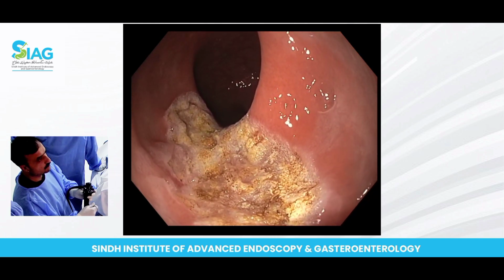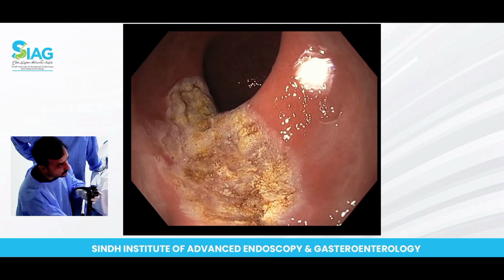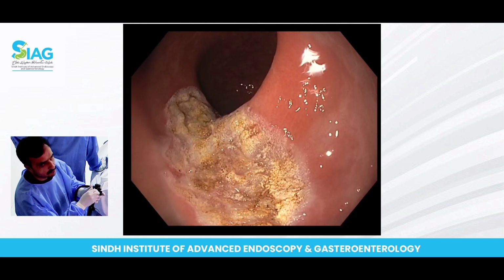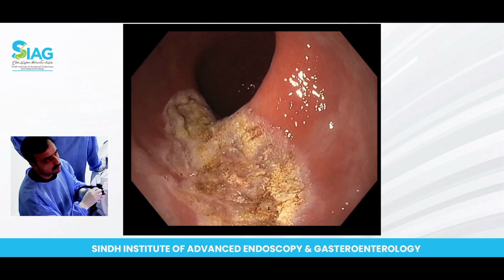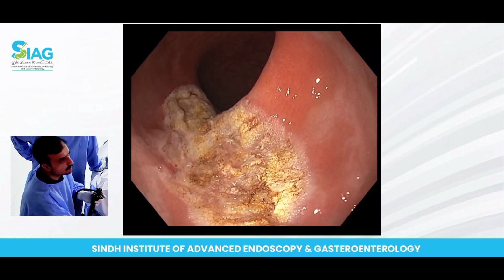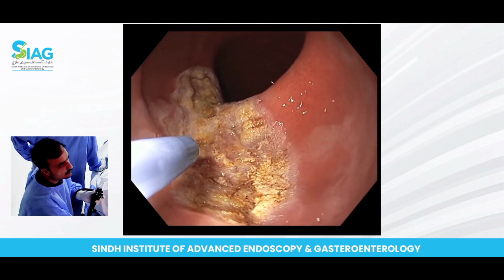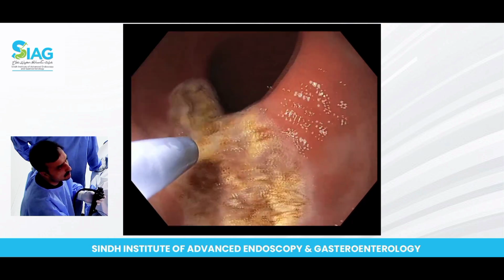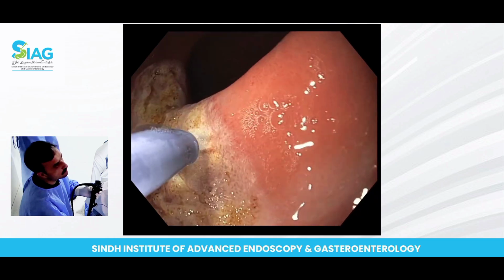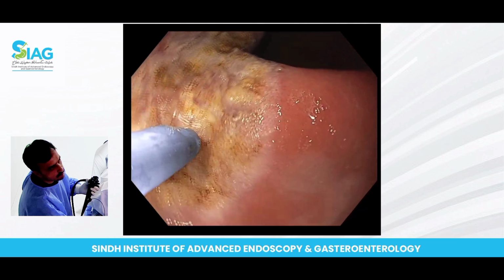There are some studies that suggest there are chances of bursting; perforation might occur due to the argon gas, which can interact with the colonic gases or the feces that is there in the colon. So especially, another thing I would like to tell is that these patients should be advised full colonoscopy preparation solution. The colon should be clean because there might be interaction with the colonic gases and it can cause a burst. So it is important to have a clean bowel, and along with that a clean enema should be given before the start of this treatment.